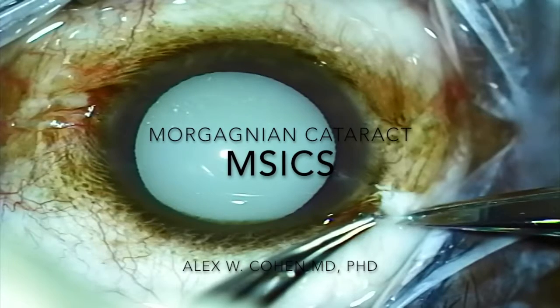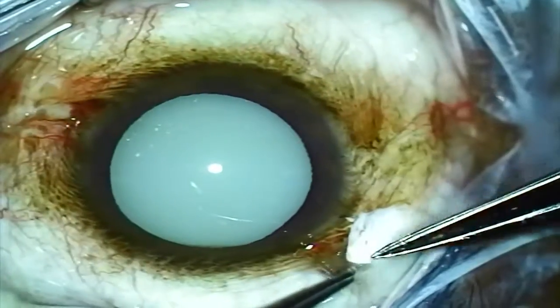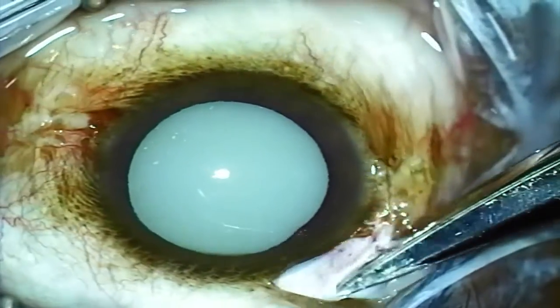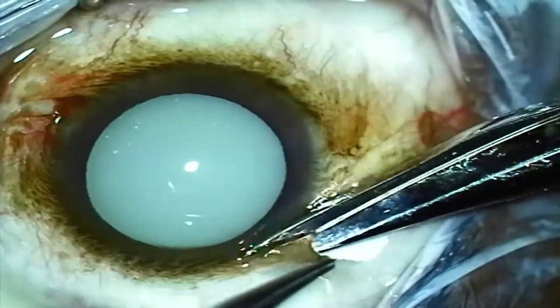This is Alex Cohen from Eye Physicians and Surgeons in Iowa City. I wanted to show an interesting case that I encountered recently while on a mission trip in southern Africa. It's a hypermature cataract that I'm going to use an extracapsular technique to remove.